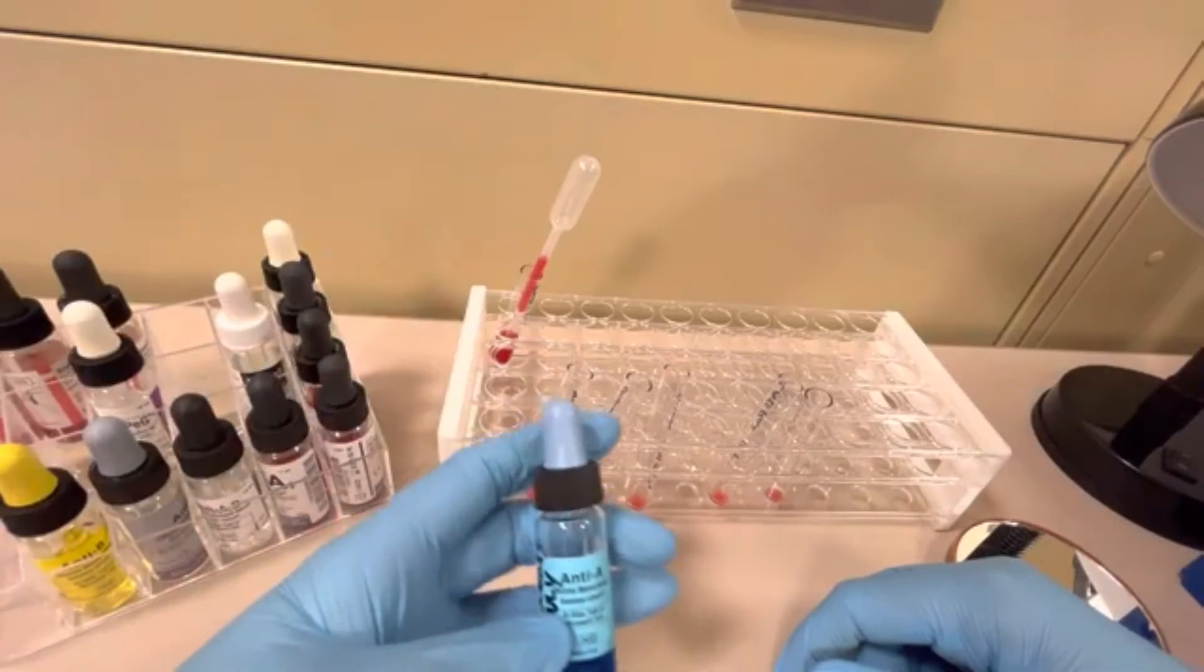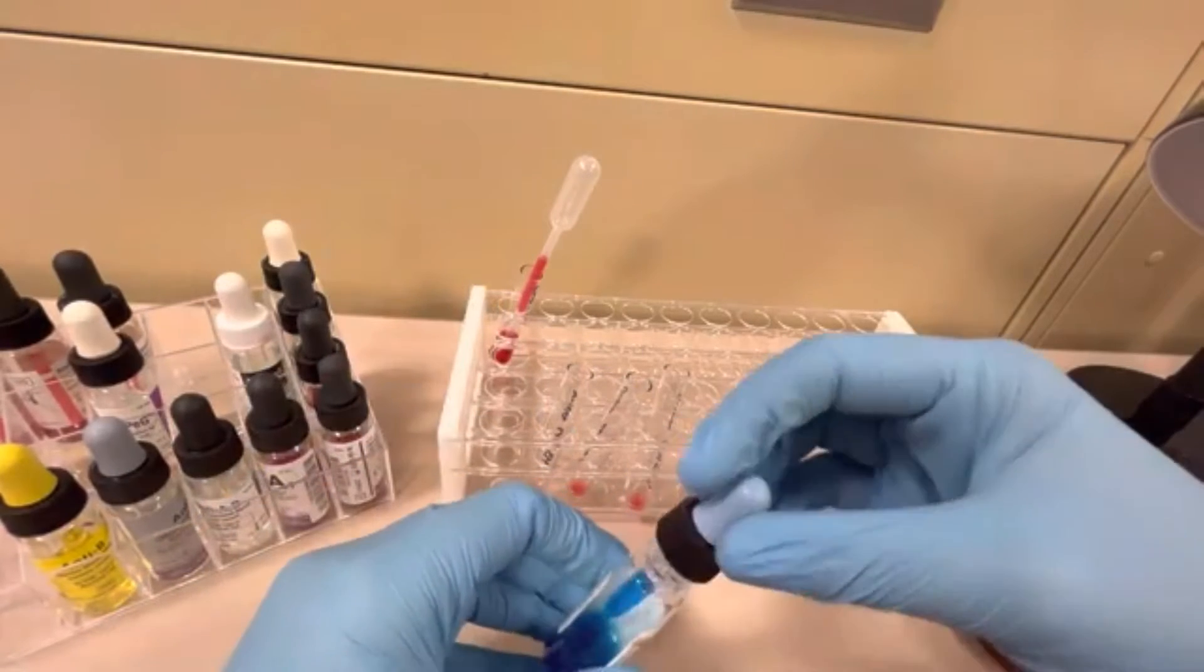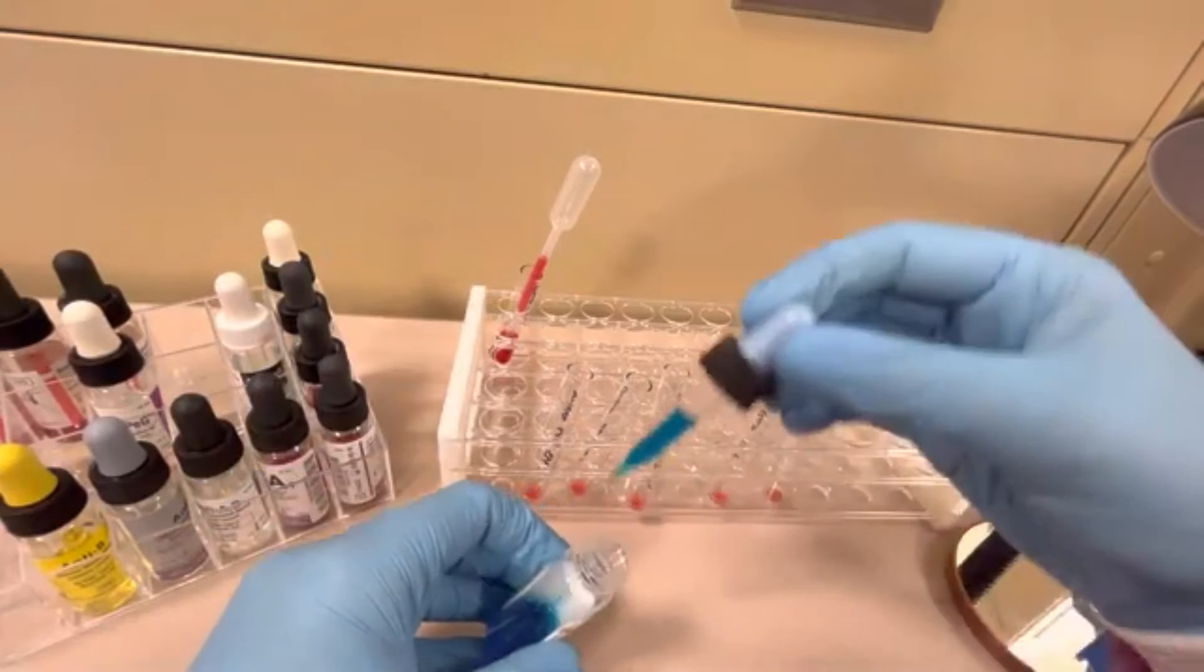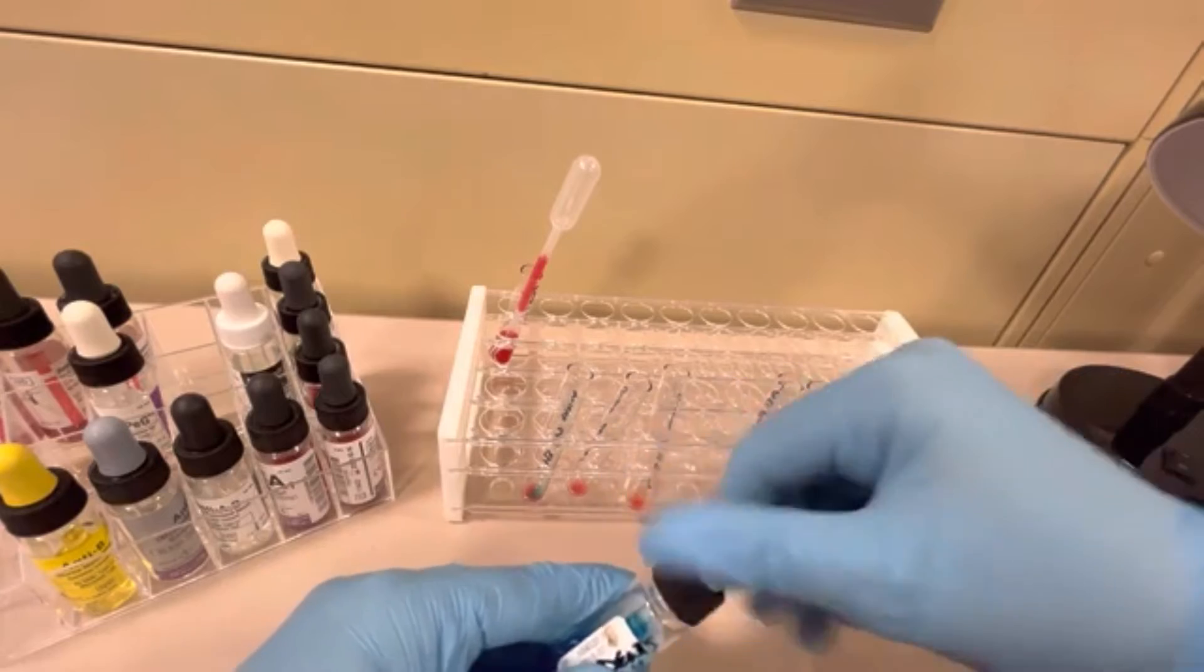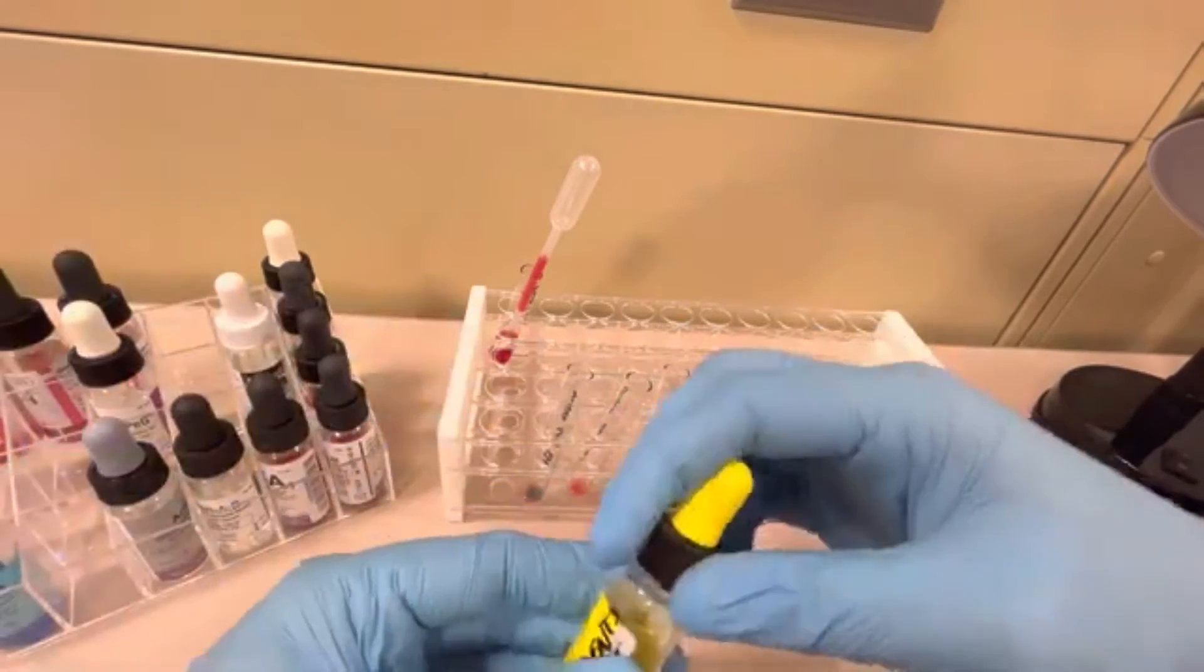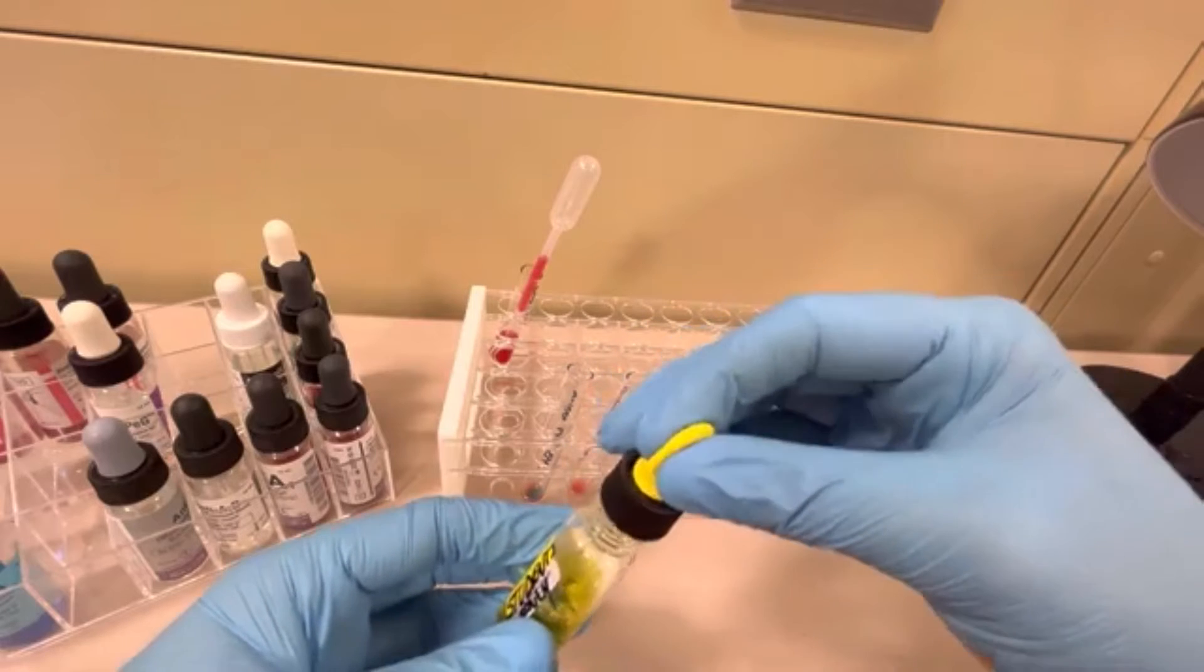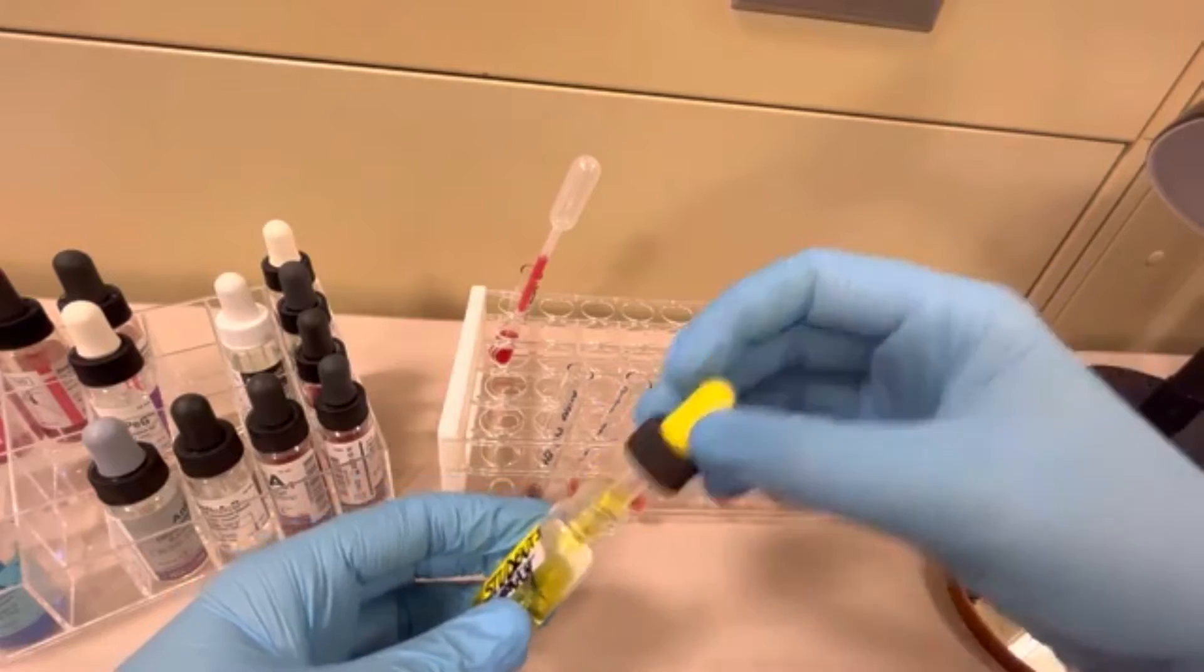Now what is next is we're actually going to do the testing, adding in the reagent. The first reagent I'm going to grab is anti-A. This is anti-A antisera. I'm going to be putting one drop of it in the anti-A tube. And then I'm going to take anti-B and put that in my anti-B tube.